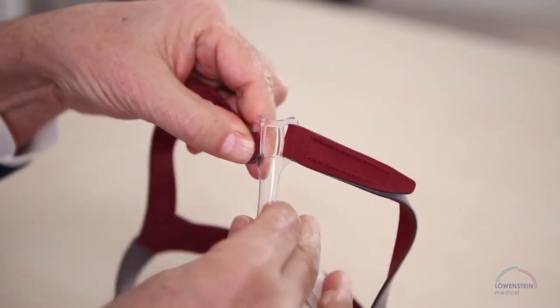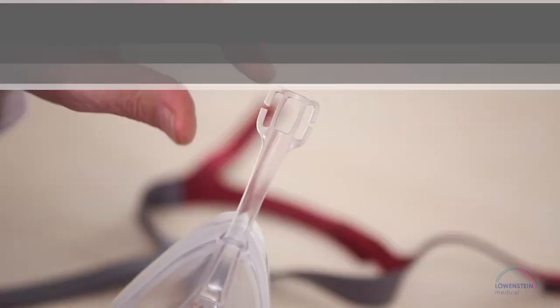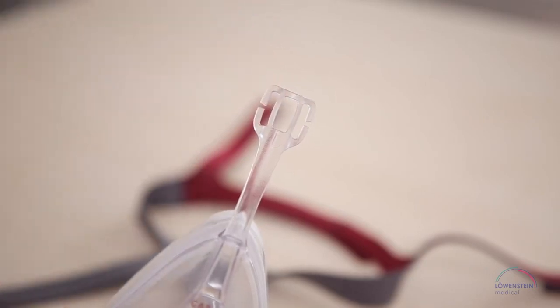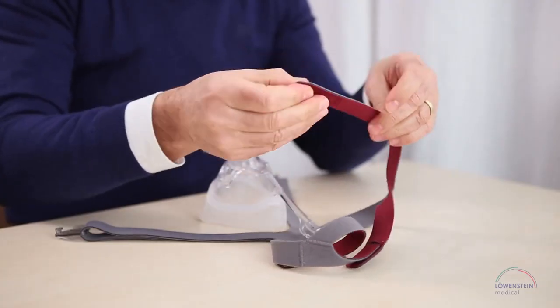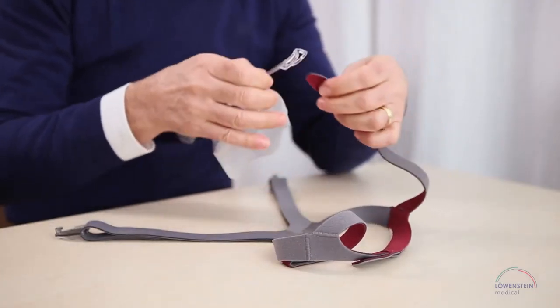You may choose, however, to use the permanently assembled variant in the middle. To do so, loosen the tabs and thread them through the opening.